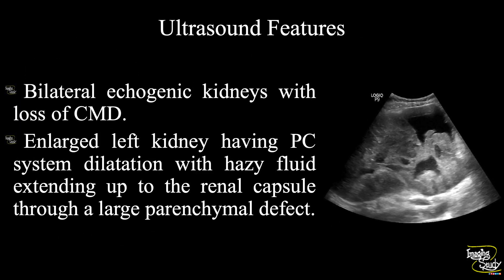In summary: bilateral echogenic kidneys with loss of corticomedullary differentiation is noted. The left kidney is grossly enlarged, having pelvicalyceal system dilatation with hazy fluid extending up to the renal capsule through a large parenchymal defect, indicating urinoma. Overall, this is a case of bilateral pyelonephritis with formation of urinoma on the left side.